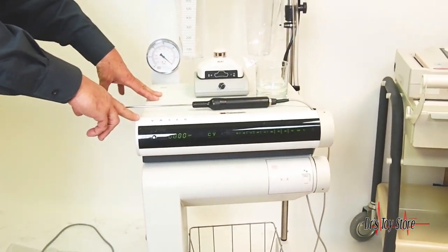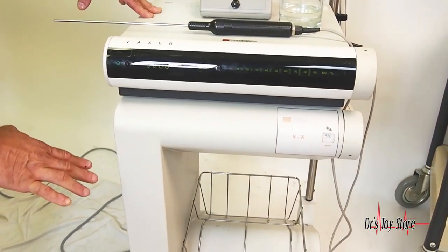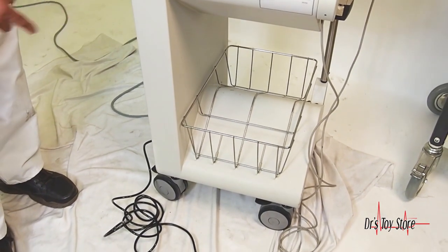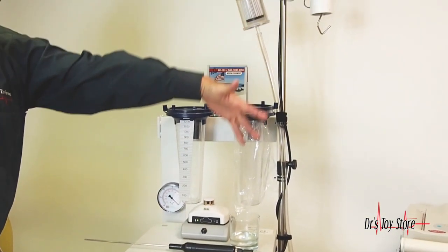Then you have, if you choose, you can just buy the amp by itself, which is all the magic in the vaser. The bottom is the Ventex. The Ventex is suction, infiltrator, and a weight — a fluid management system — to see how much fluid is going out.